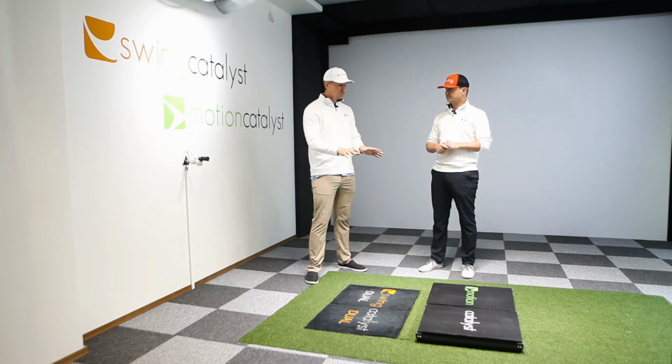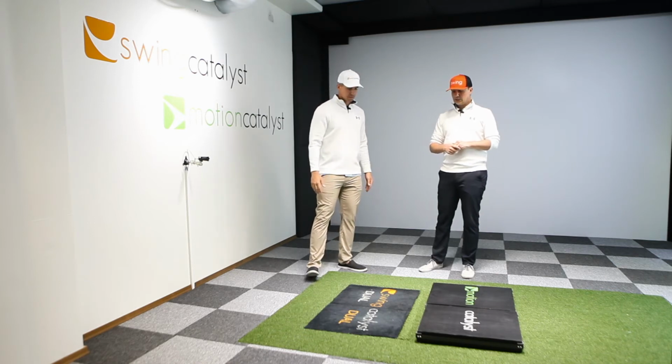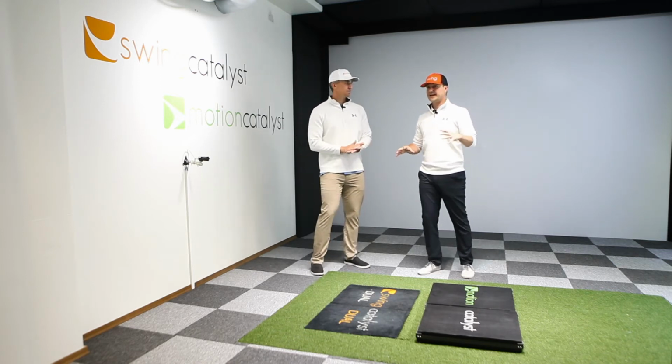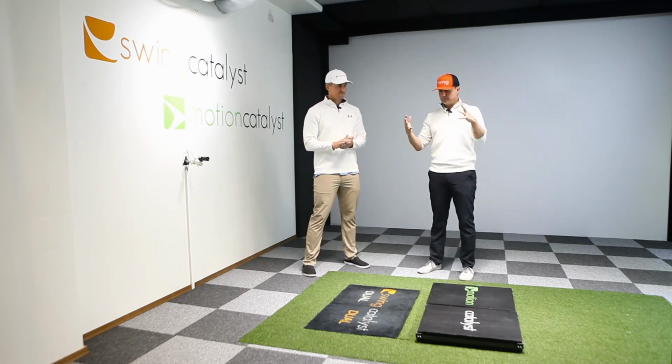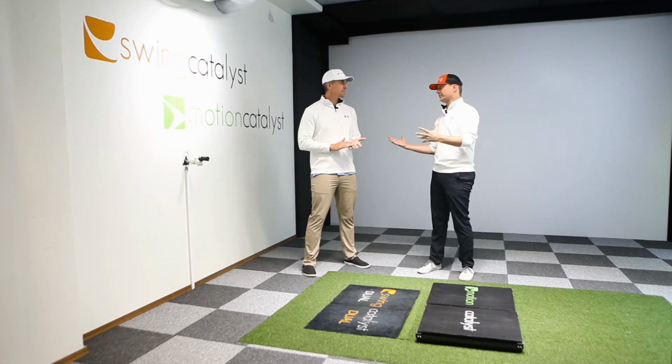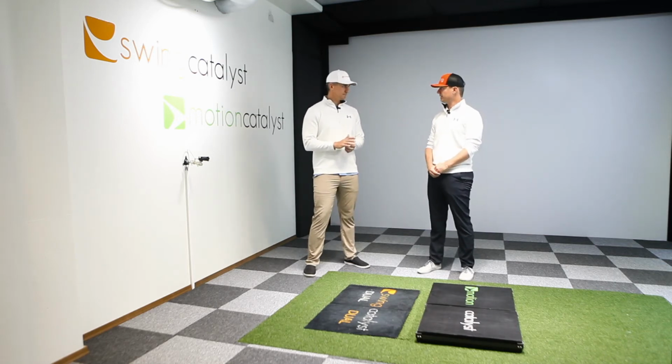Now this holds true across all force plates, all softwares. Everything is predicated on the fact that body weight is measured correctly. And these are collecting at 1,000 hertz, so they're collecting 1,000 pictures every second. So very small micro movements will be picked up. That's one of the benefits of these force plates, but also one of the detriments if your athlete is just messing around a little bit, any kind of wobble, any kind of sway.